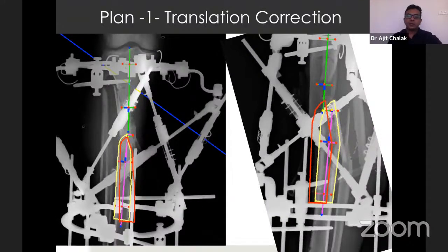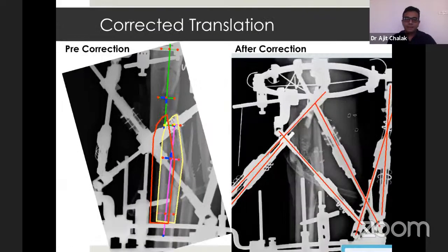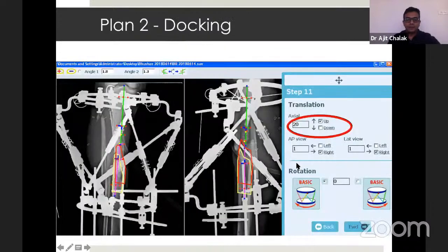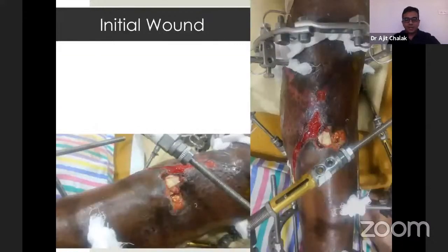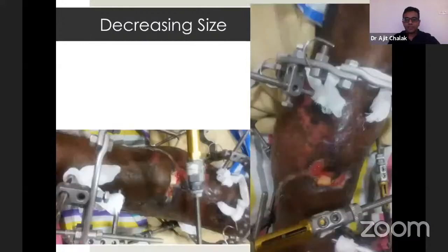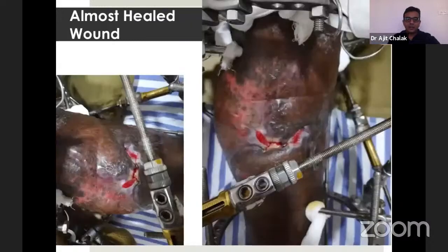Plan 1 for translation correction was made with the Ortho SUV fixator and the translation was corrected. The left-sided picture is the pre-correction picture and in the right-sided picture you can note the translation is corrected. In plan 2, a 20 mm docking in the upward direction of the distal fragment was made. As we started docking, the wound started decreasing in size and ultimately reduced considerably.